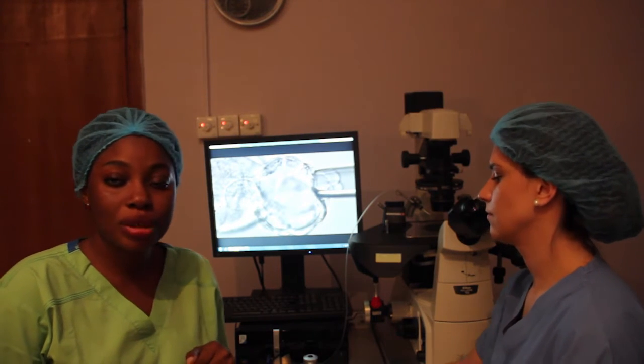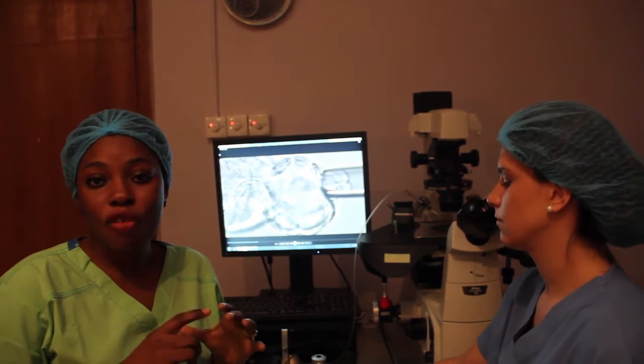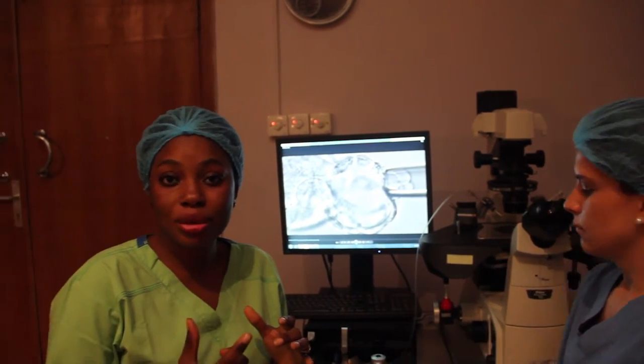So in essence, what we're trying to explain is that for us to have a complete PGD cycle, sometimes we will need more than one IVF stimulation. And IVF stimulation is the process whereby we would recruit embryos that are needed for PGD. Now, the process of PGD is very sensitive, so we would need good quality embryos. There are lots of hurdles for us to cross.